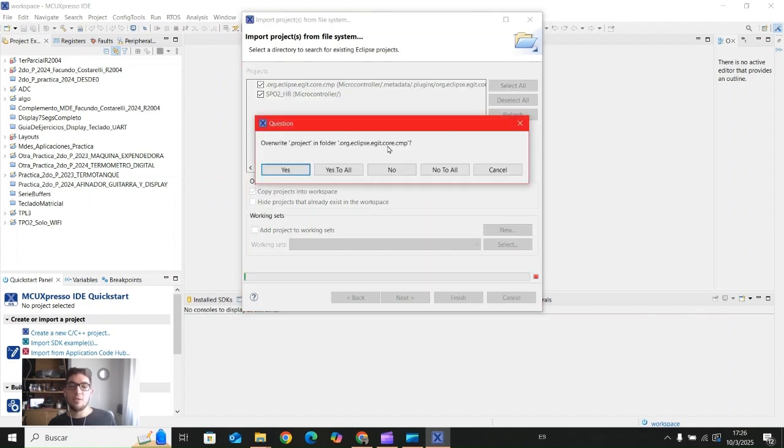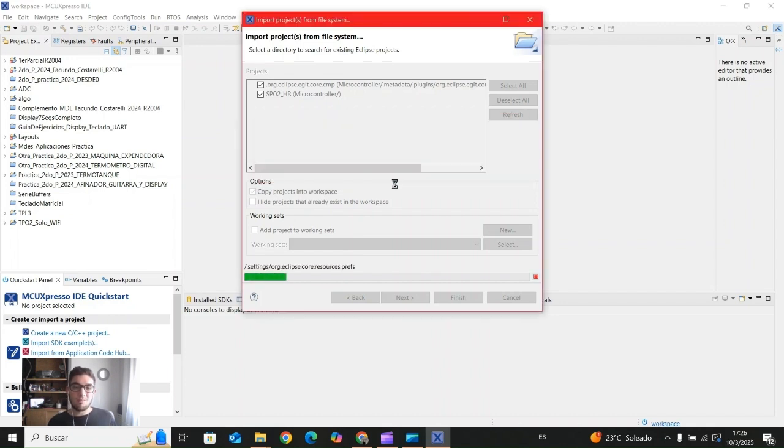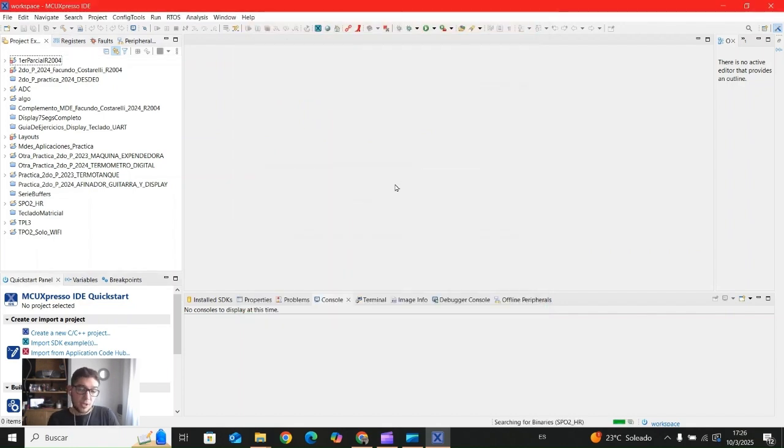It asks if we want to overwrite the .project folder. That would be like maintaining or not the configurations of the original project. So we are going to click on yes to all because we want to overwrite and have the settings right. You see here the root related to the settings. So yes to all. Right now we are just saying okay, we want to have the same configurations and setups and everything that was done by the other person with that project. We want to keep that. We don't want to change that. Also the MCU configurations we want to keep.